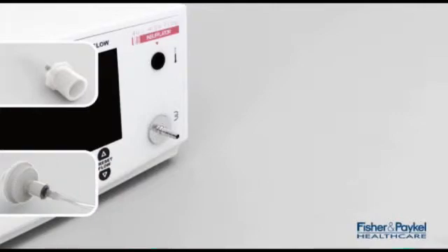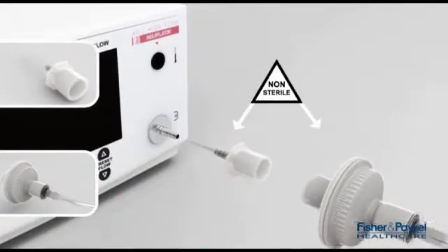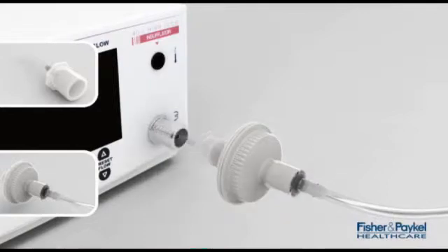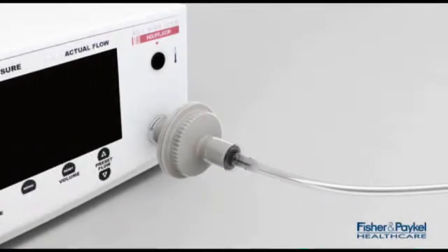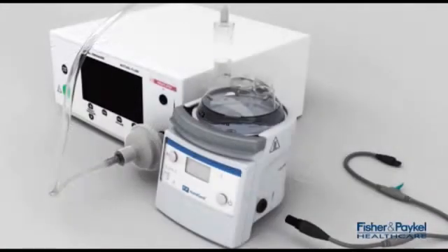Double check the insufflator gas outlet port in case you require the adapter supplied in the Humiguard kit. Connect the filter onto the insufflator gas outlet port and the other end of the dry line to the other chamber port.